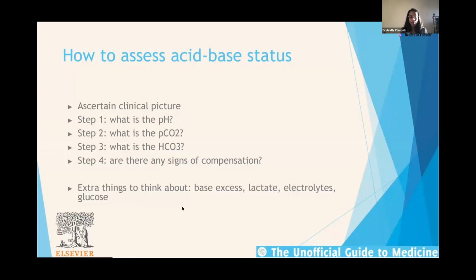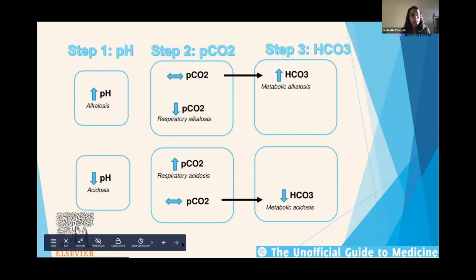And glucose level. Obviously, we all know that you can get glucose level with capillary blood gases anyway, so that's nice and quick, but it's just something else that will come out on your ABG reading.